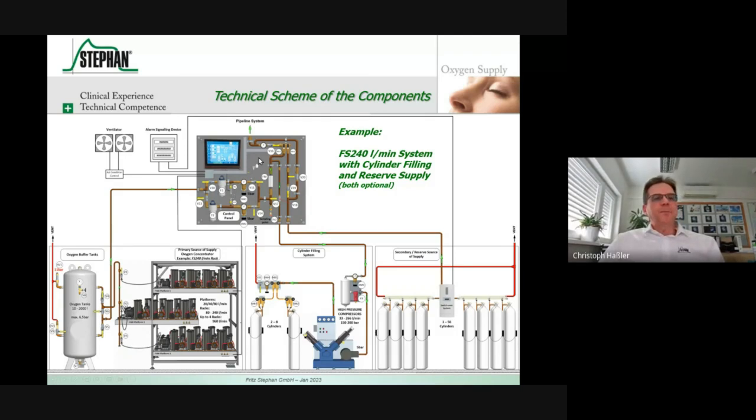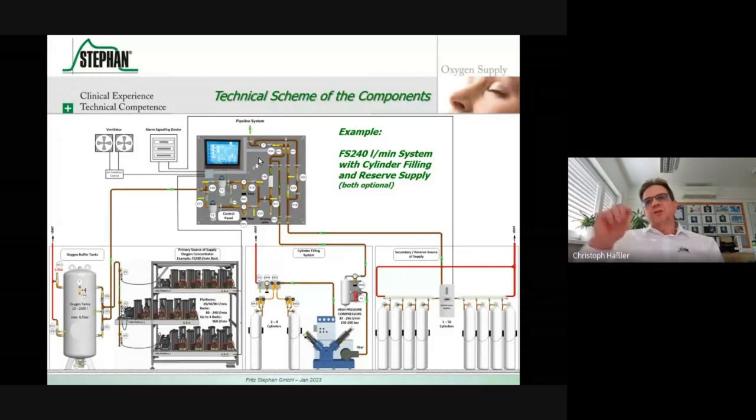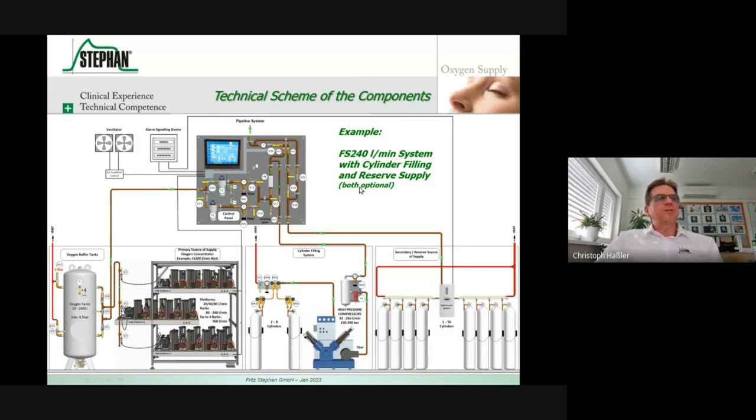To be honest, we are not allowed to do that here in Europe, but we do have in Africa in some systems, and also in some military applications, we are asked to implement a function that says, even if the product gas is out of the pharmacopoeia under 90%, so this is password protected or with a switch key, please give us the ability that the system does not fall back to reserve supply. And so we had to implement that for army purposes, because they said we do not have an alternative out there in the field hospitals.